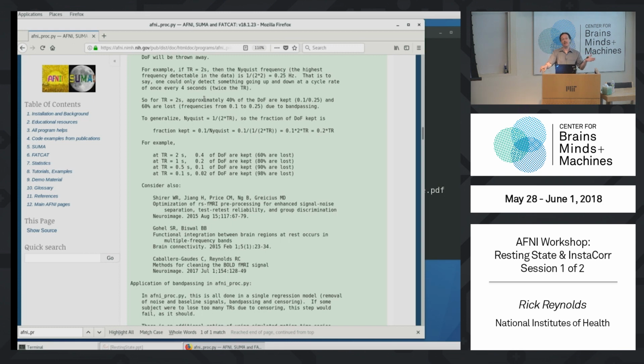And that's what was happening, and actually in a lot of the earlier papers telling you how to analyze your data, they're in the negative degrees of freedom, but still publishing these results. So that's why it's nicer in a safeguard way to put this all in regression models, so you see the impact of this. You know how many degrees of freedom you're using and how many are left.